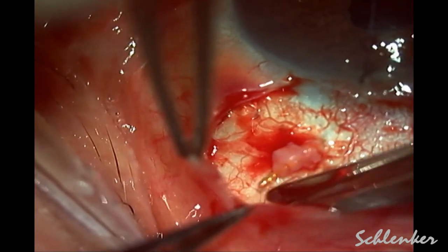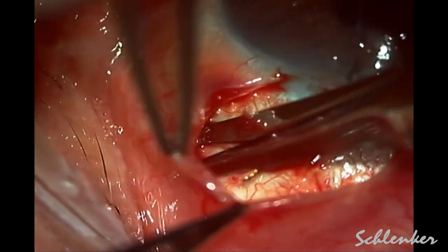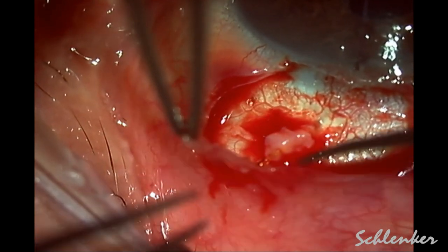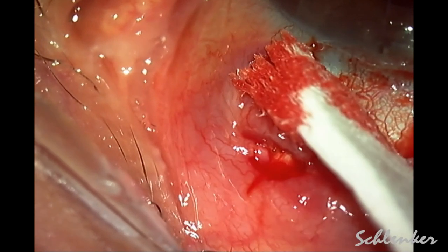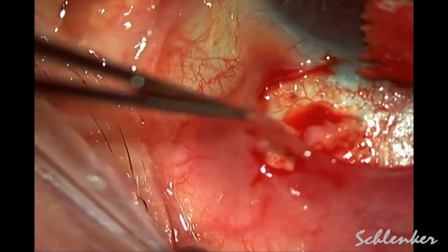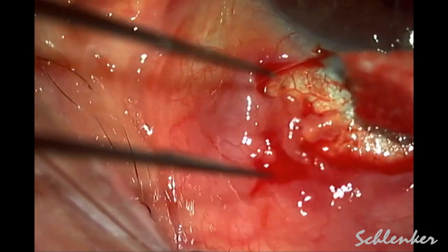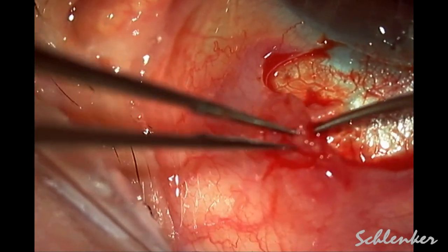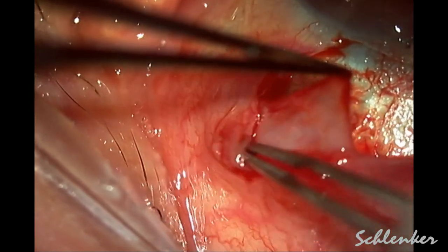We then hoped to close this area and reestablish the flow that was present for many months. We were a little torn about what to do with the fibrous tissue around the Xen, because we did not want to amputate or occlude in any way this micro stent, which was flowing quite well. During our dissection we did encounter a buttonhole that we had to address, but thankfully there was a significant amount of conjunctival tissue available.